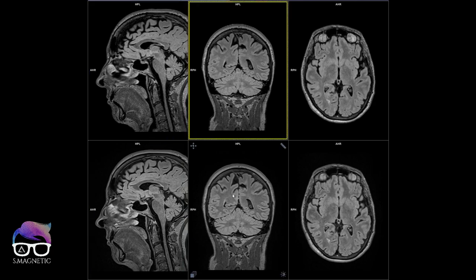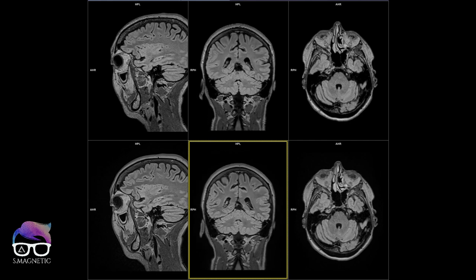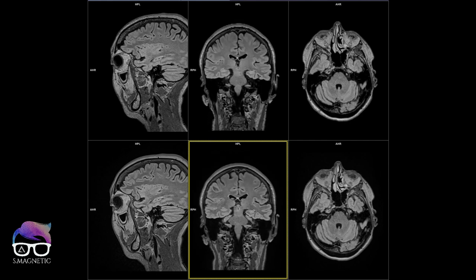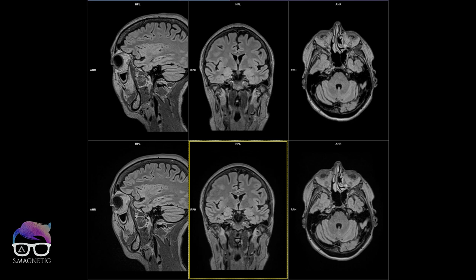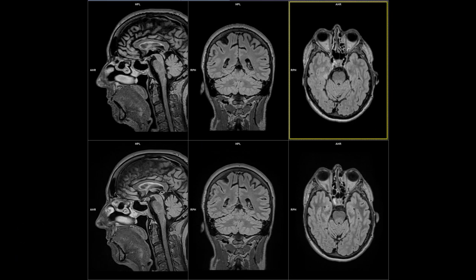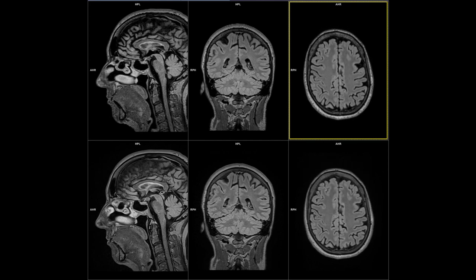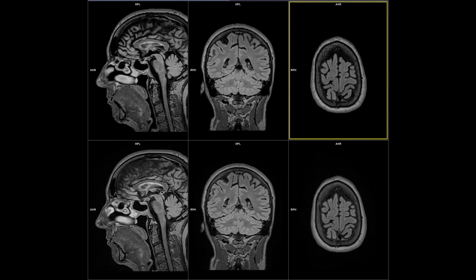Let's check the coronal plane. You can see there's no FIT artifact on top of the brain. The image quality is still good in the reconstructed images. And then transversal — so this is the same scan time, but we also managed to remove the artifact.